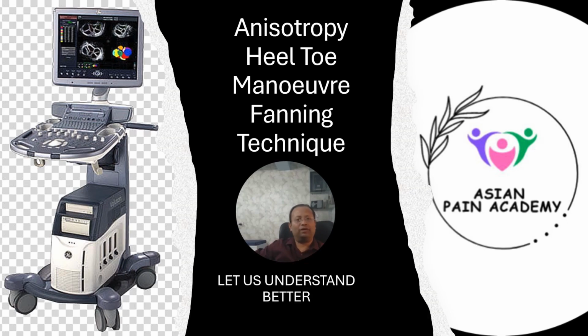Anisotropy, heel toe maneuver or fanning technique. How are they related? So first question is what is anisotropy?